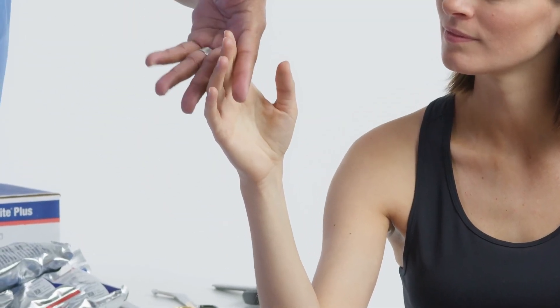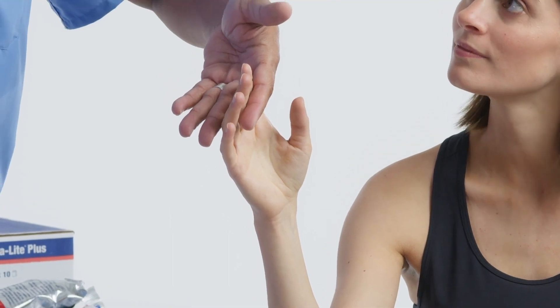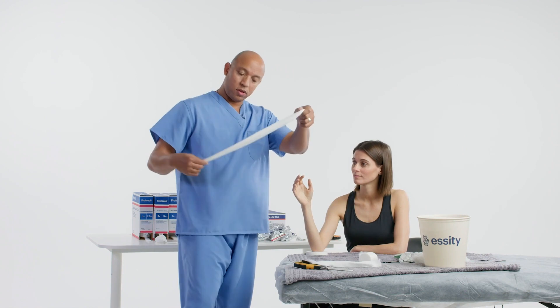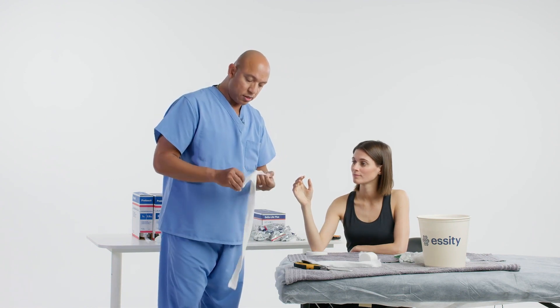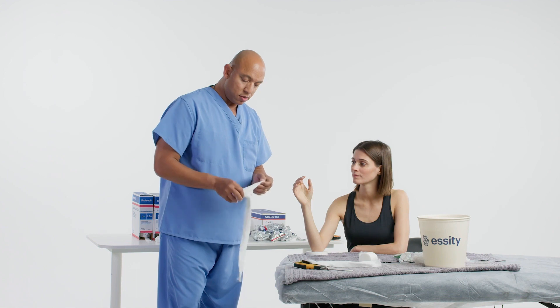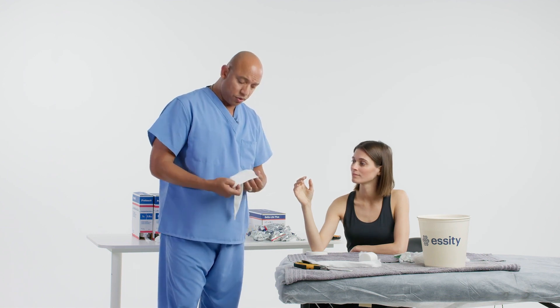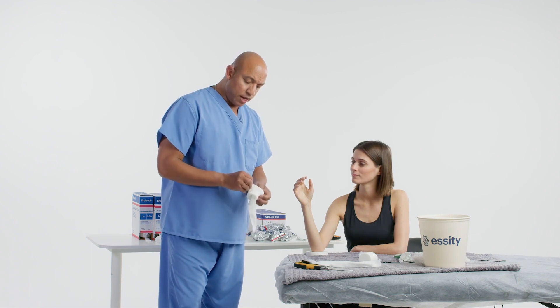Have the stockinette terminate at least to the PIP joint of the fingers. So here's my stockinette — we'll open this up and roll it down on the patient's extremity. Be careful to be gentle.